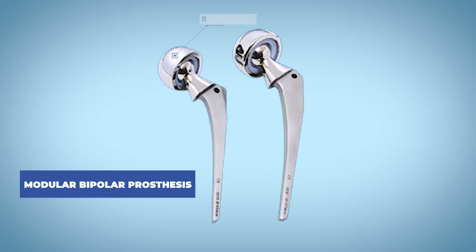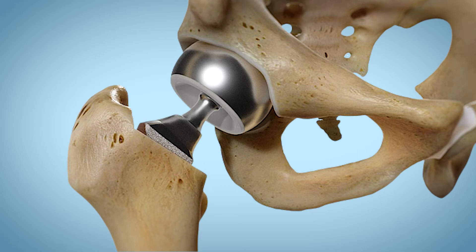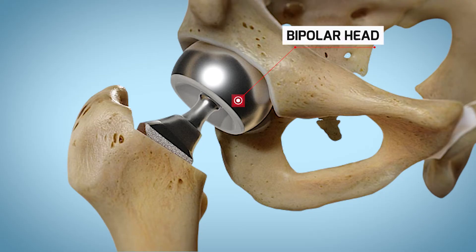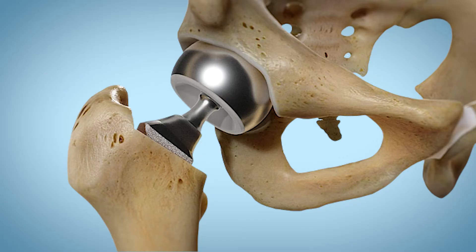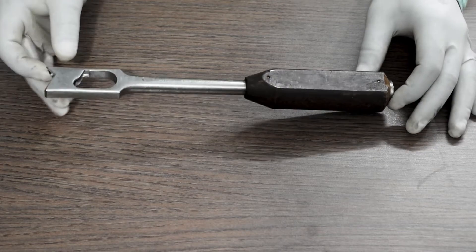A modular bipolar prosthesis is divided into three parts: a bipolar head, a neck, and the femoral stem. During this surgery, the surgeon first removes the head of the femur which is broken or diseased, then the end of the femur is hollowed out. The femoral stem of the bipolar implant goes into the hollowed out part of the femur. Once the femoral stem is placed, the head of the stem is fitted with a ball, which swivels to limit wear and tear on the joint. The ball is then placed in the socket and the joint is tested.